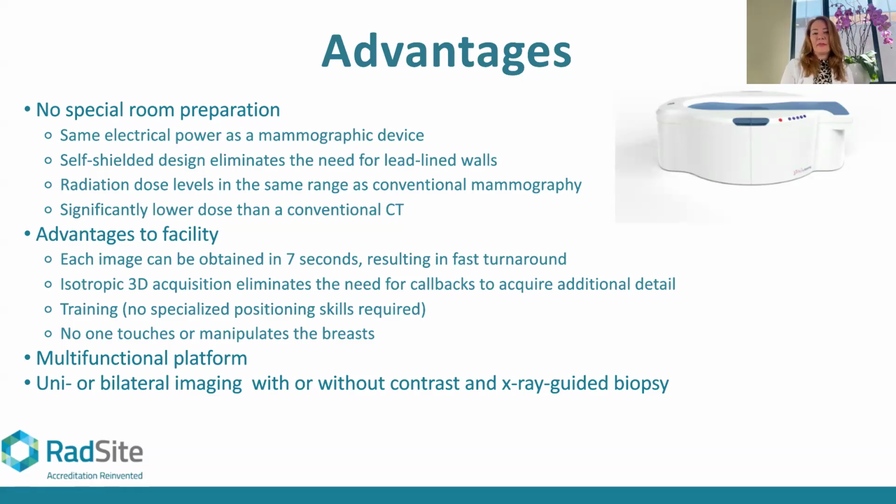When we get this type of study, I have everything in one step. If that patient has something abnormal, I know the extent of it, I know the position. If we decide to perform a biopsy, I can use the machine to guide a tissue sample to that area very easily. Or we can choose to look around to see, can we identify it with ultrasound? And an ultrasound biopsy can also be performed. If that returns a diagnosis of something I need to take action on as a surgeon, I have everything done.